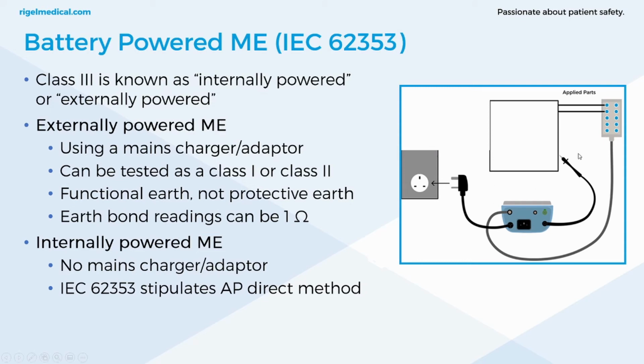Also, you might be asking, what are the risks with an internally powered device? Well, let's imagine that the conductive parts of the device have come into contact with some other electrical source. Could be via the device, could be via a user, and it could just be providing very low levels of electrical current.